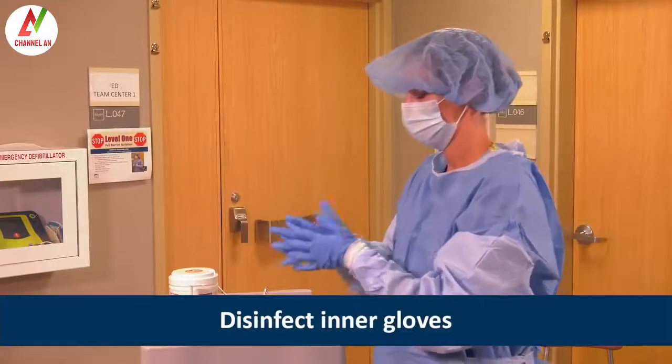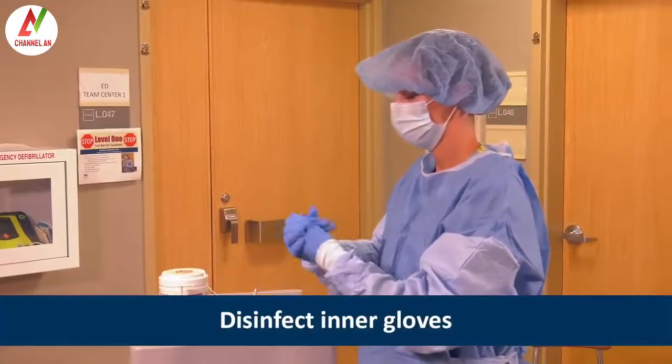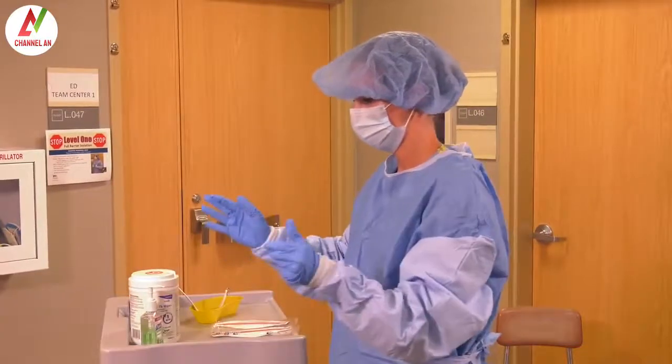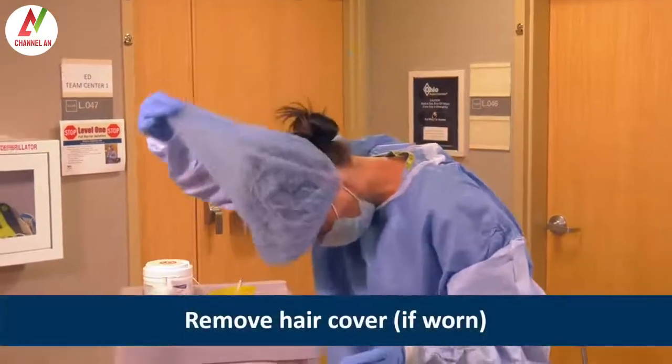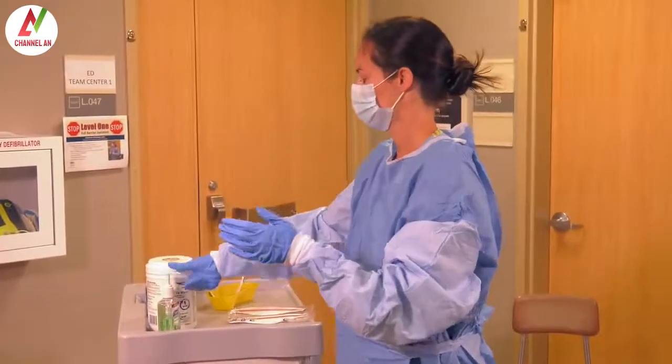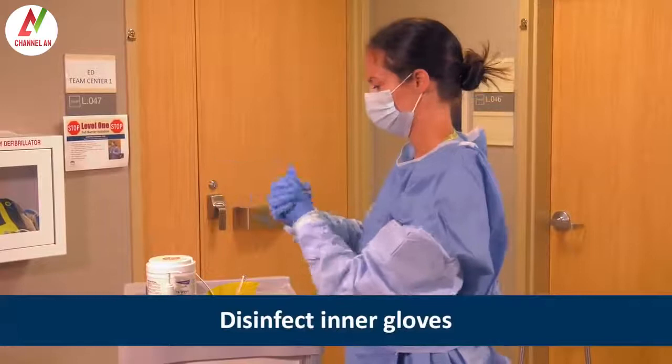After removing the face shield and disinfecting the inner gloves, Heather removes and discards the hair cover if worn. To do this, she tilts her head slightly forward and pulls it off. Next, she disinfects the inner gloves again.